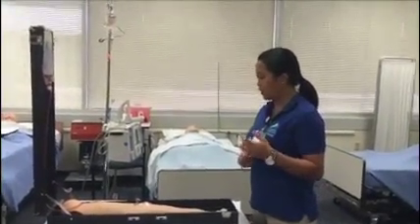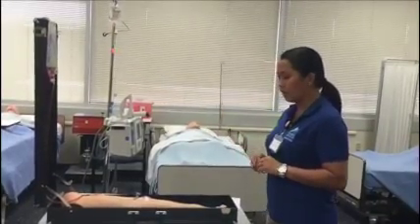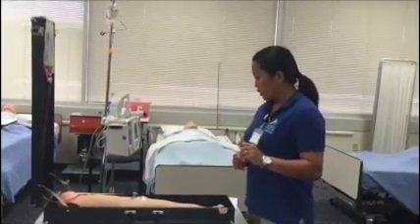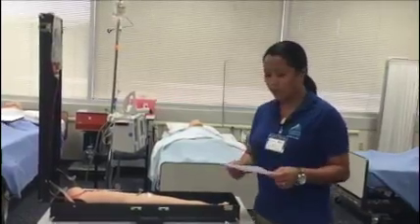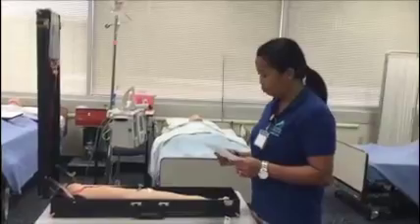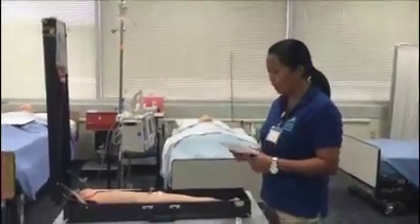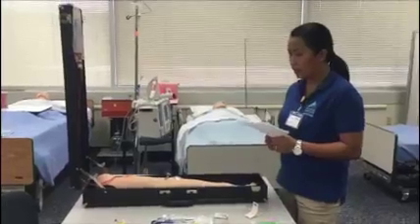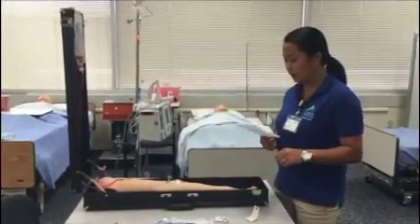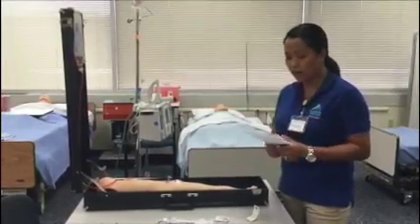I want to demonstrate the piggyback IV line, and I have my MAR right here. I'm checking the doctor's order and verifying the correct medication, the dose, the route, the frequency, and everything else. I will make sure that everything is right.